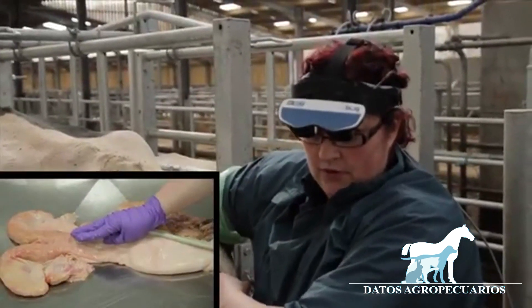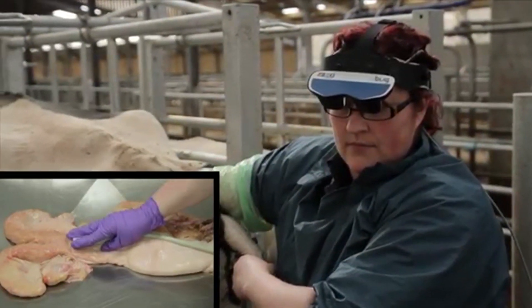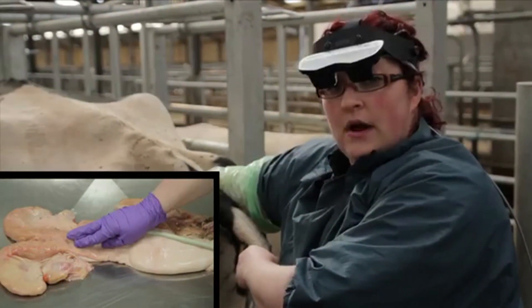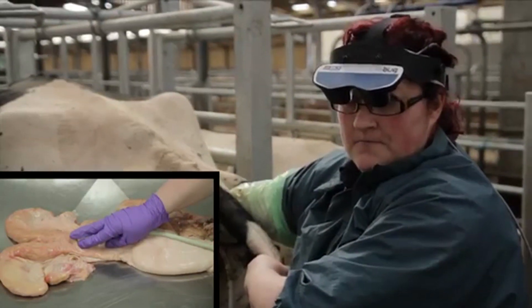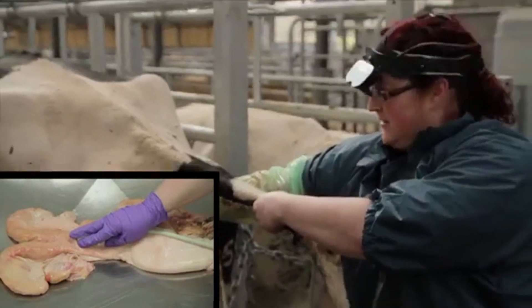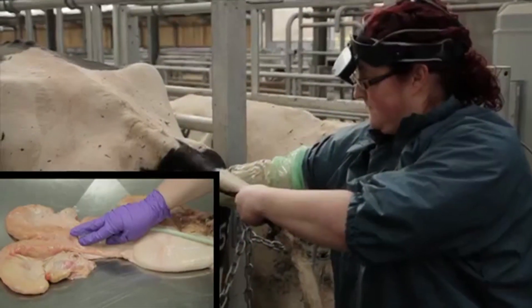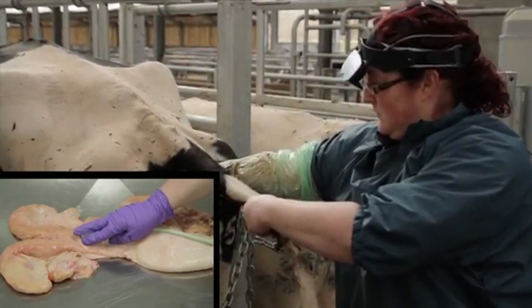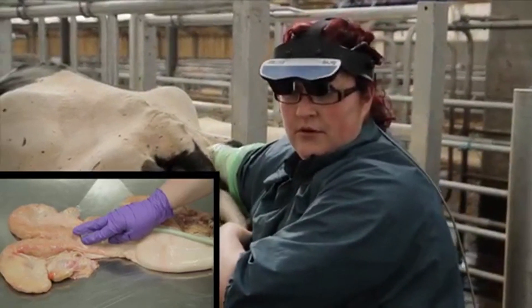We'll again come to the cervical region. We can retract the uterus into the pelvic canal if need be, though we don't need to do that in this particular cow. If the cow begins to strain, just allow it to pass until they relax, and then gently proceed inwards.